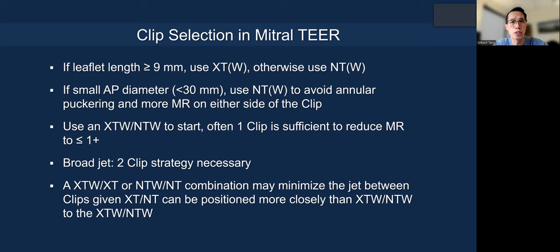With the G4 system, you can start with the XTW or NTW — the wider clip — and usually one clip is sufficient to reduce MR to one-plus or better. However, for a broader jet, you need a two-clip strategy from the start. We prefer using a wider clip (XTW or NTW) first, and if a second clip is necessary, use an XT or NT, because having a wider clip and a narrower clip together reduces the jet between the clips and minimizes the gap.